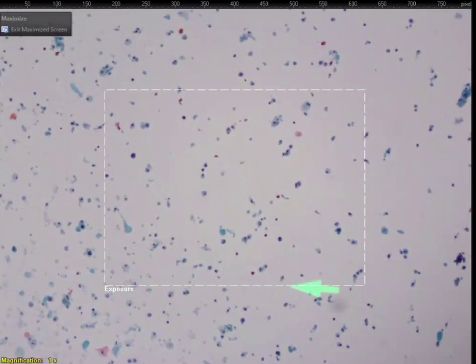The lining of the cyst. What kind of lining? It's squamous cell lining, but they're from the embryo. Embryonal remnants. So those can also have miniature squamous cells, but they should not have abnormal looking squames or even keratin debris.